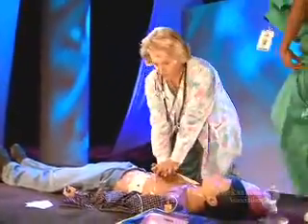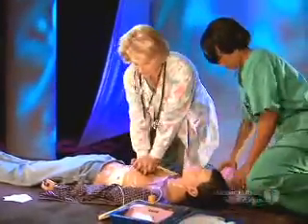Repeat this sequence of CPR and AED use until advanced life support providers take over or the victim starts to move. So, now you know how to use an AED with 2 rescuer CPR.